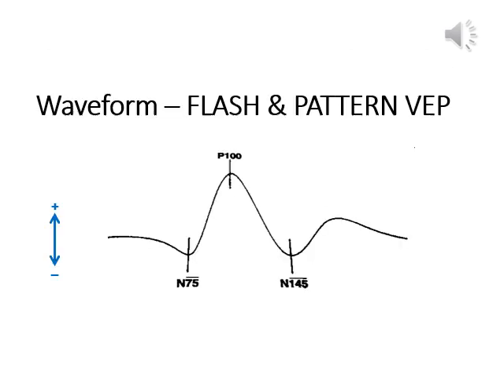The typical VEP in an adult is a triphasic wave consisting of three components: the N75, P100, and N145. The VEP is typically shown as positive up in the guidelines, and so the P100 is a positive going, upward going waveform at about 100 milliseconds.